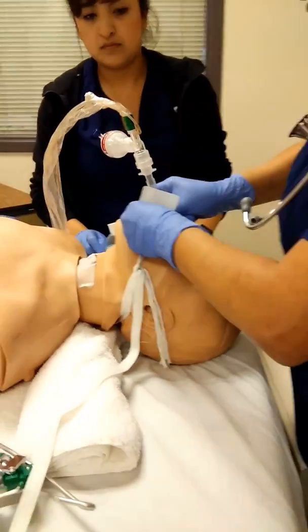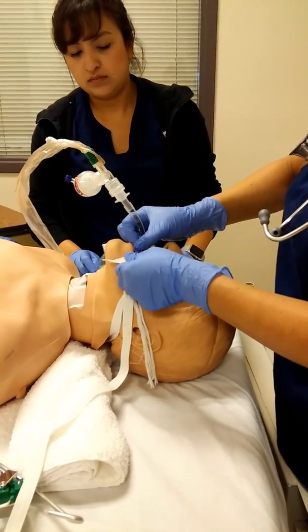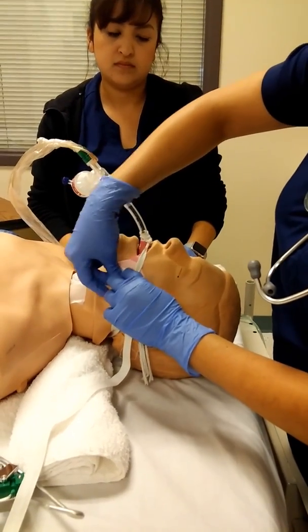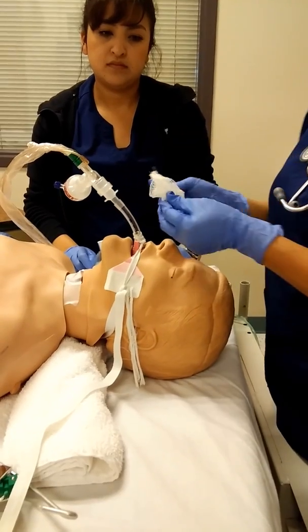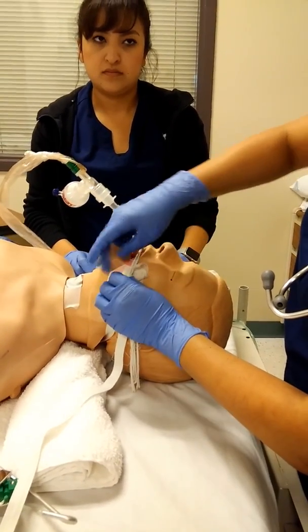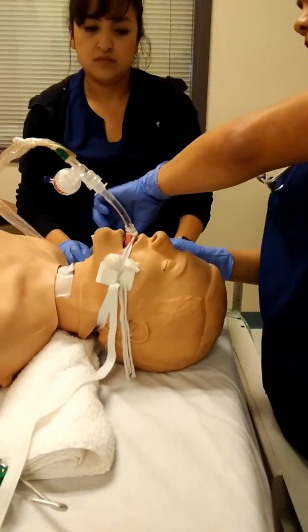Okay, so you just place that in there. And then you would just use this just to go ahead and you would remove the tape to secure it. Then you would just add the gauze so that the patient could not get any skin lesions or anything like that.